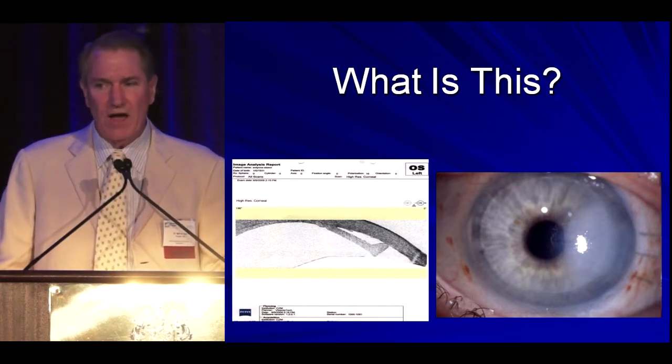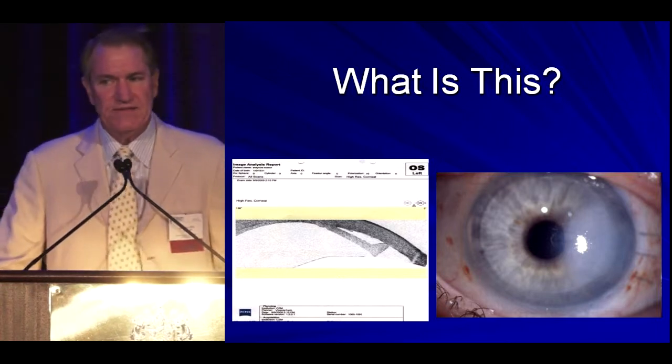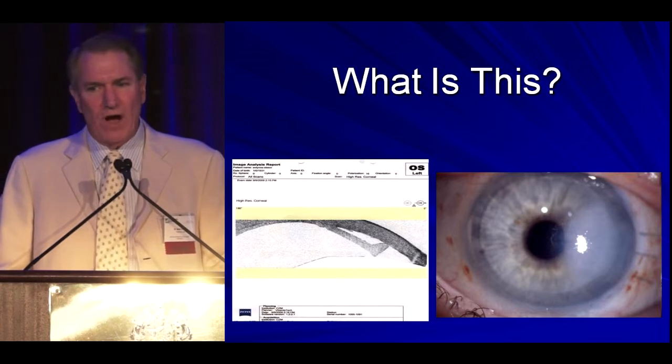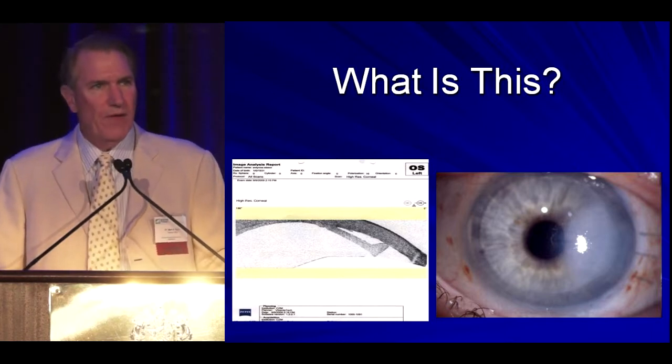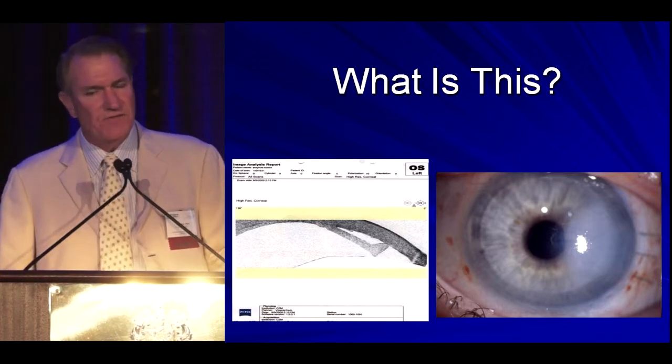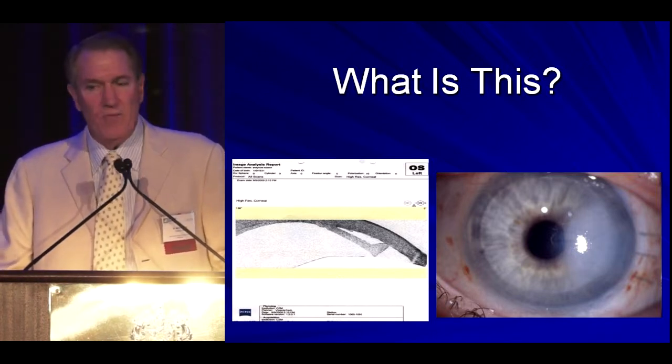This is an example of an eye that had surgery, and 6-8 weeks later, they still have this massive edema. And why? Because they have a separation of that peripheral edge of the graft. And that's an architectural separation. That is because there's a full thickness on that edge.